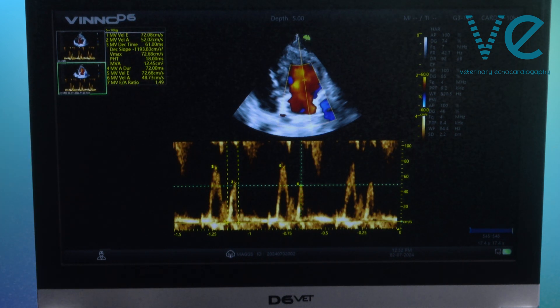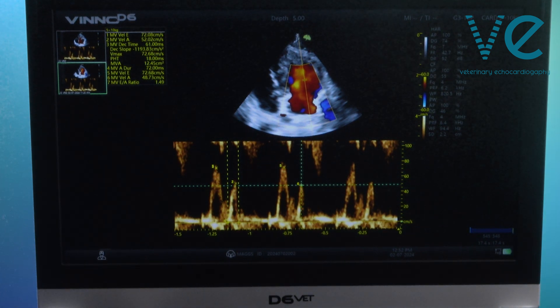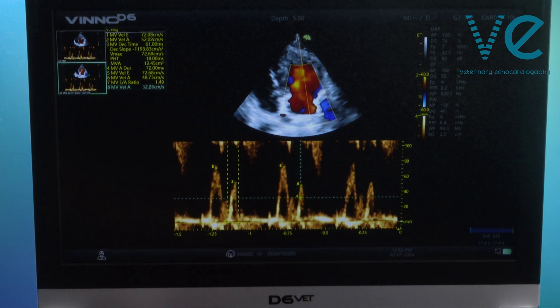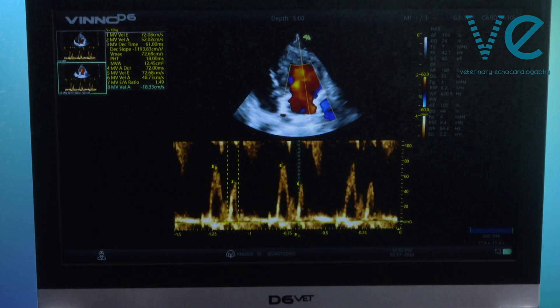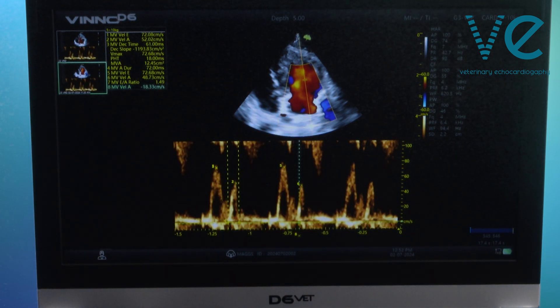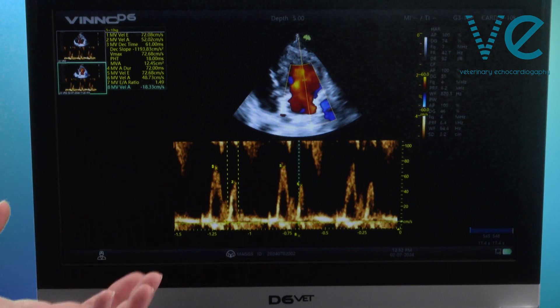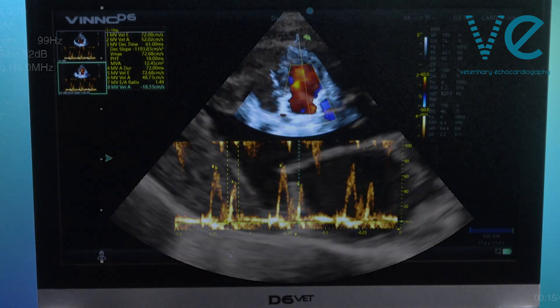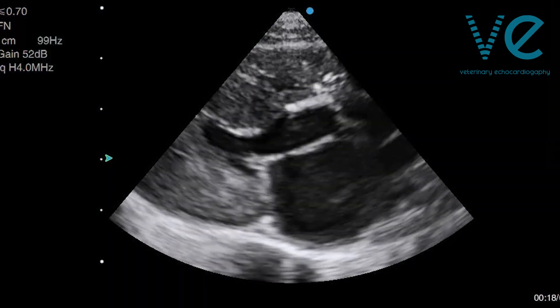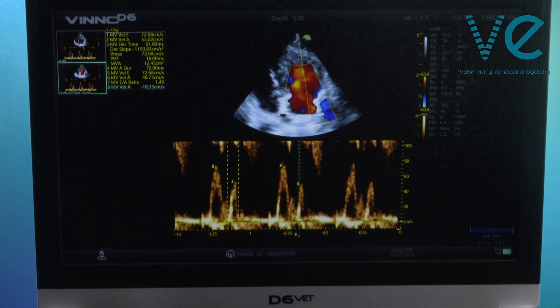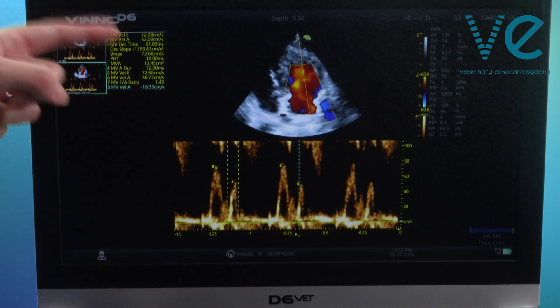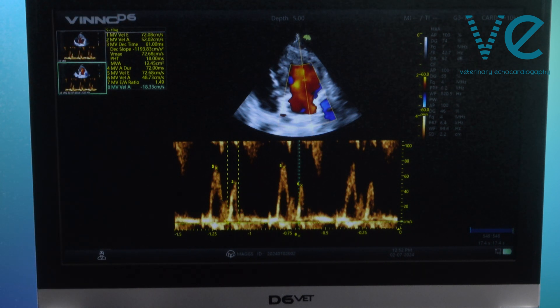You can look up what normal EA ratios are, but you can actually use your eyes most of the time. If the E wave is taller than the A wave, that's usually a sign of normal diastolic function. If that didn't match what you were seeing clinically — if you saw thick walls and a dilated left atrium — well then you might suspect pseudo-normalisation, and that's where some of your other measurements would be important.